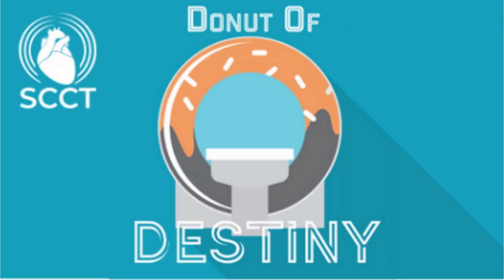Right, Praveen. Partner 3, as the name indicates, is the third installment in a series of multi-center randomized control trials on the safety and effectiveness of balloon expandable TAVR valves compared with surgical valves for symptomatic severe aortic stenosis. As Praveen mentioned, Partner 3 focused on low-risk surgical patients who had less than 4% predicted mortality risk at 30 days post-procedure. For the original Partner 3 trial, 1,000 patients were recruited across 71 international sites, primarily in the US.